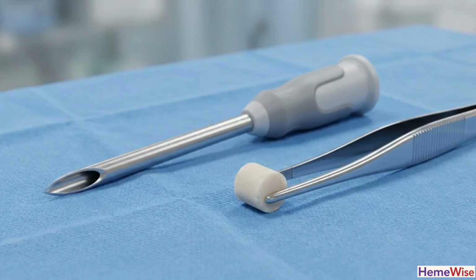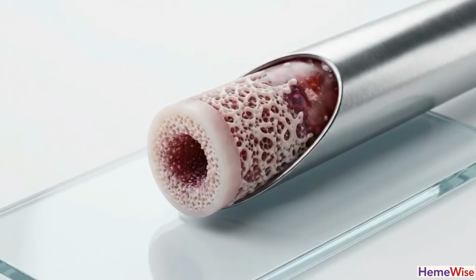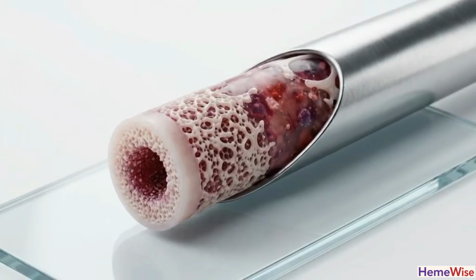The second half is the solid trephine biopsy. By removing an intact cylindrical core of bone and marrow, we preserve the structural architecture, the spatial distribution of cells, and the marrow's overall cellularity.